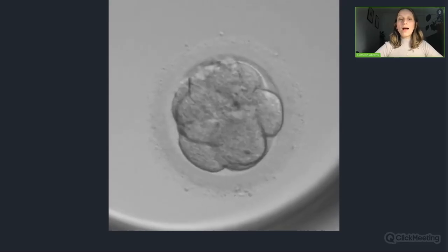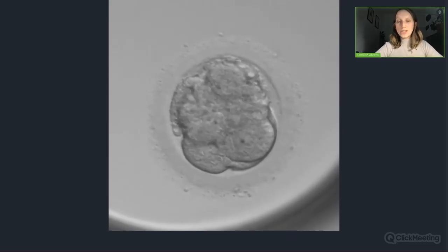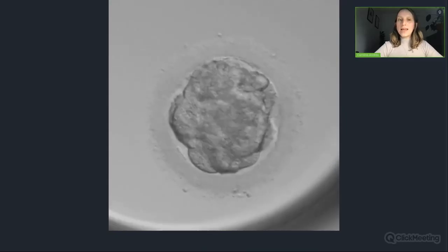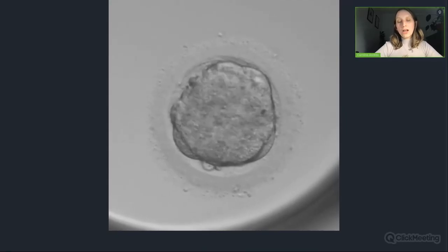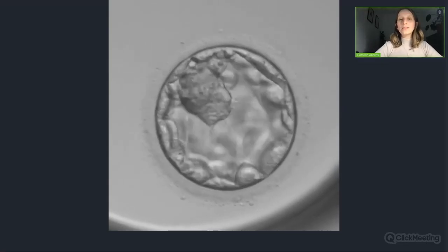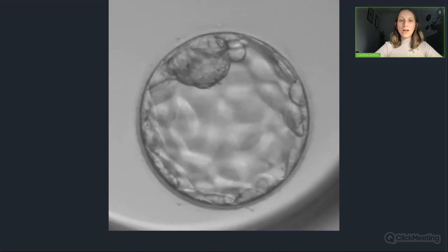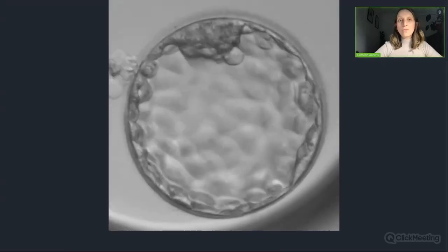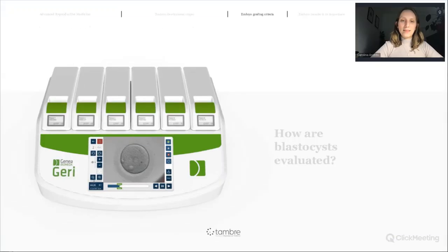So now this is the next part of the presentation, where we're going to talk about blastocyst evaluation. Nowadays, we perform a long culture until day 5, day 6, because it's the way that we're going to select our embryos indirectly. We are only going to select those embryos that have the capacity to form the blastocyst and therefore have the capacity to implant.